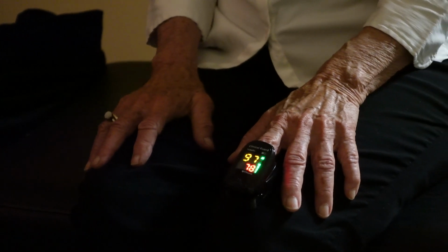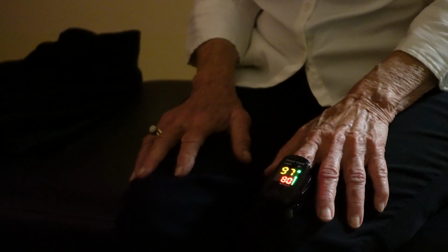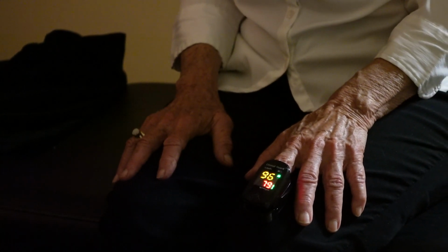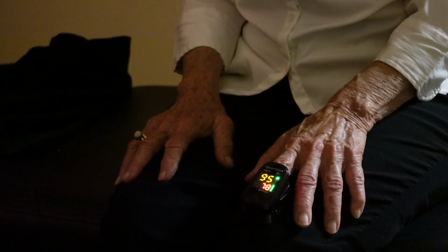So it was 92, now it's up to 97%. You're not getting good respiration. That's oxygen. And it's going to be really hard to get your balance under control unless we get oxygen to your brain. As you can see, her oxygen saturation is pretty low at 92%, 94%.